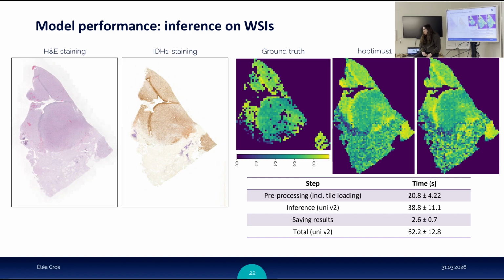It was always in the direction of overestimating, by 10 or 15%. And when you co-trained, probably the model learned that these tumors look a bit different. Okay, so kind of recalibrating the instrument for this specific tumor type.